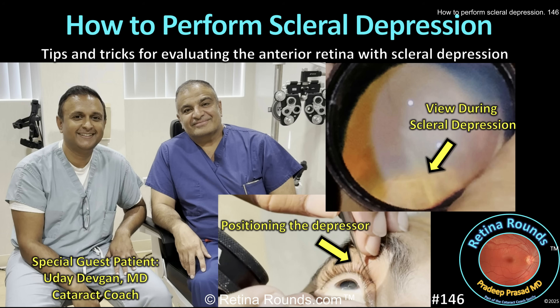We've received a number of requests for a video on how to perform a scleral depressed examination. Today we'll go over some basics as well as tips for success. Our very special guest is none other than the cataract coach, Dr. Uday Devgan, who graciously offered to be the patient for this video.